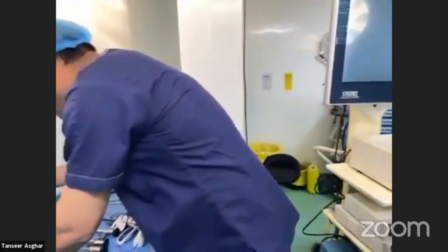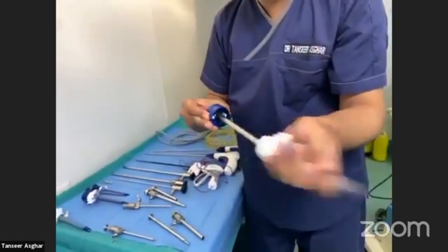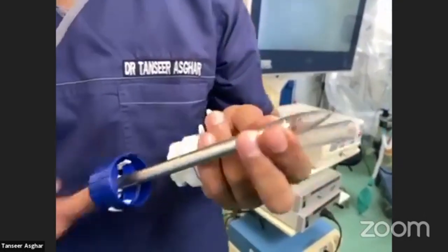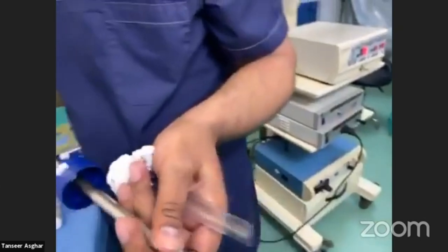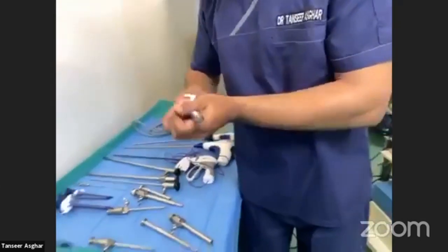Then there is another type of trocar usually available in disposable ports. It is called an opti port or optical port. When you put the camera telescope inside it, you can visualize every layer on the screen. So this covers the main types of trocars.